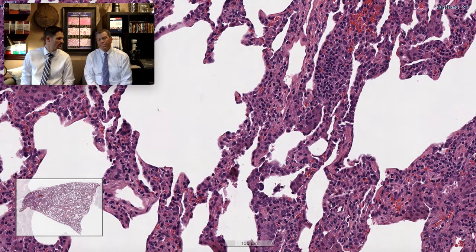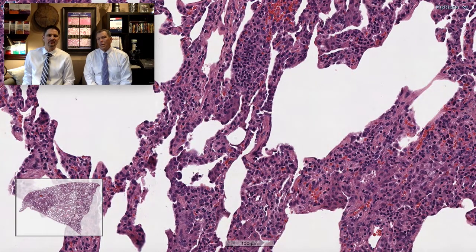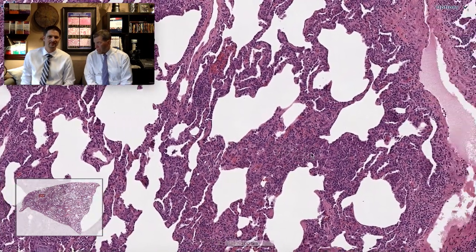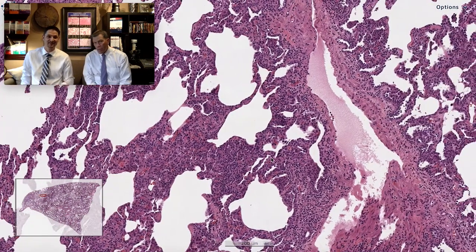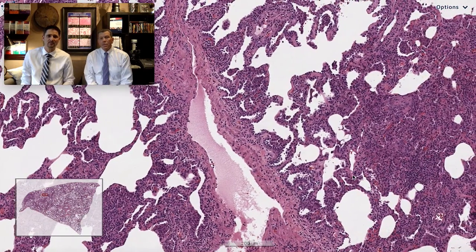It looks a lot like what they say in the textbooks — cellular nonspecific interstitial pneumonia to me. NSIP. Cellular NSIP. They say that's a starting point and never an ending point. Like many diagnoses in pulmonary pathology, it's not really a diagnosis; it's a description of a pattern, which in fact the cellular infiltrates overall pattern is basically a cellular NSIP.